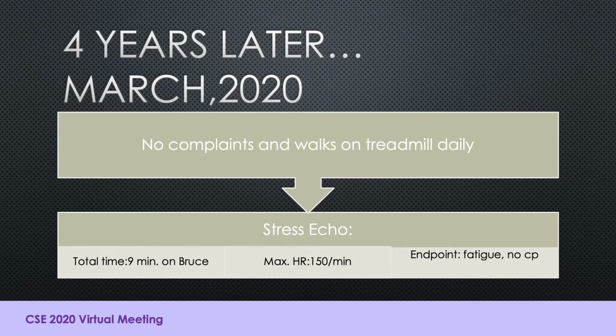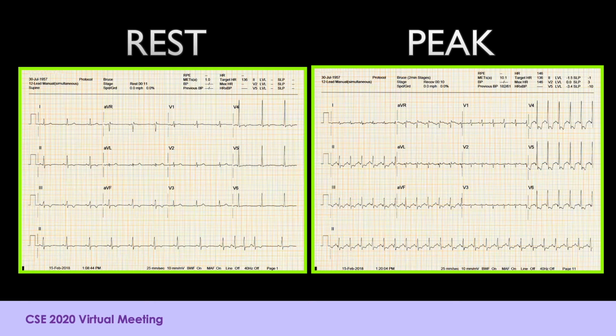4 years later, I'm seeing him with no complaints, but he's referred back for another stress echo. He goes 9 minutes on a Bruce, heart rate 150, endpoint fatigue. He indeed does have significant ST depression laterally, which he's had for the last 18 years.